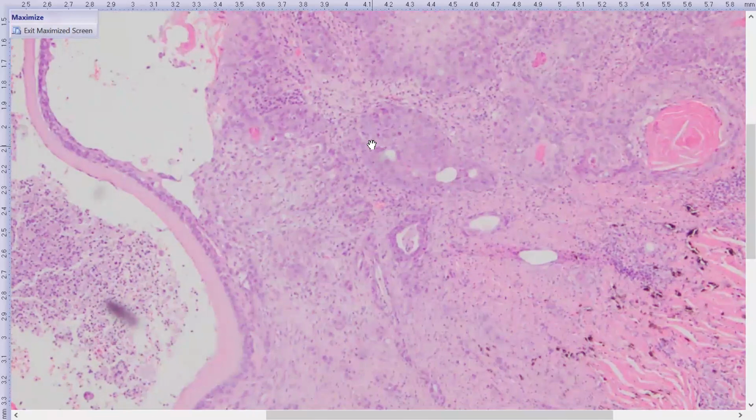Basically, squamous cell carcinoma probably arising in the corneal or conjunctival surface, or basically what we refer to as a conjunctival adenocarcinoma in cats with a squamous differentiation. That's kind of splitting hairs. Either way, this is a really malignant carcinoma, which has basically destroyed a lot of the eye, significantly destroyed the cornea, and then moved inside the eye into the uveal stroma. That is this case in a cat.